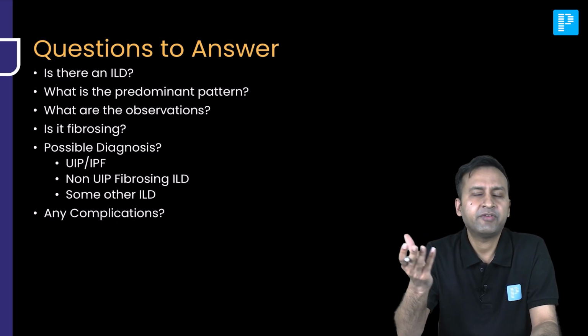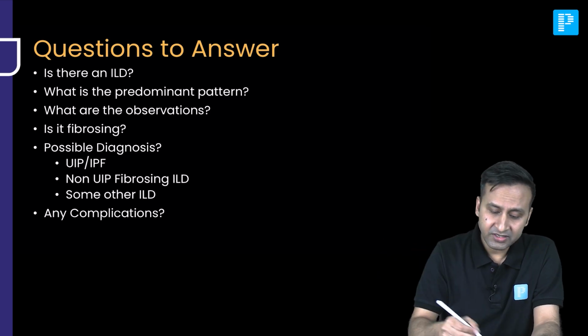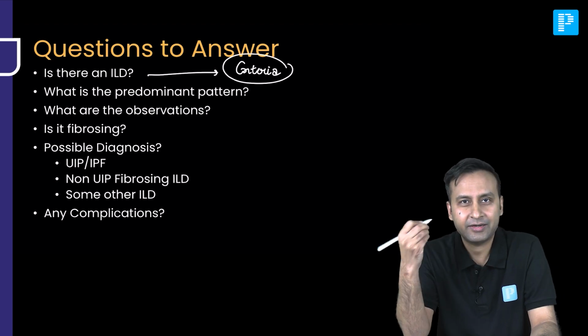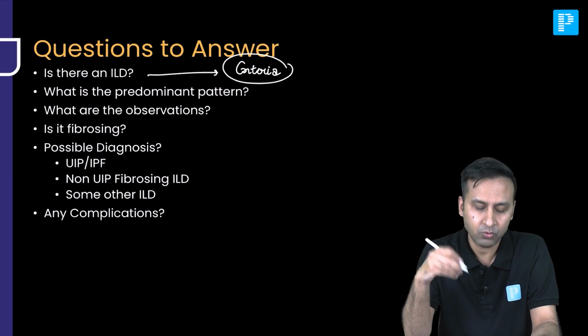come across a number of abnormalities like some fibrosis, some nodules, some reticulations. So what is that particular criteria which is good enough to call a disease an interstitial lung disease? So this is what we're going to understand right now. We've already discussed the signs of interstitial lung diseases. We'll be again extrapolating them over here.